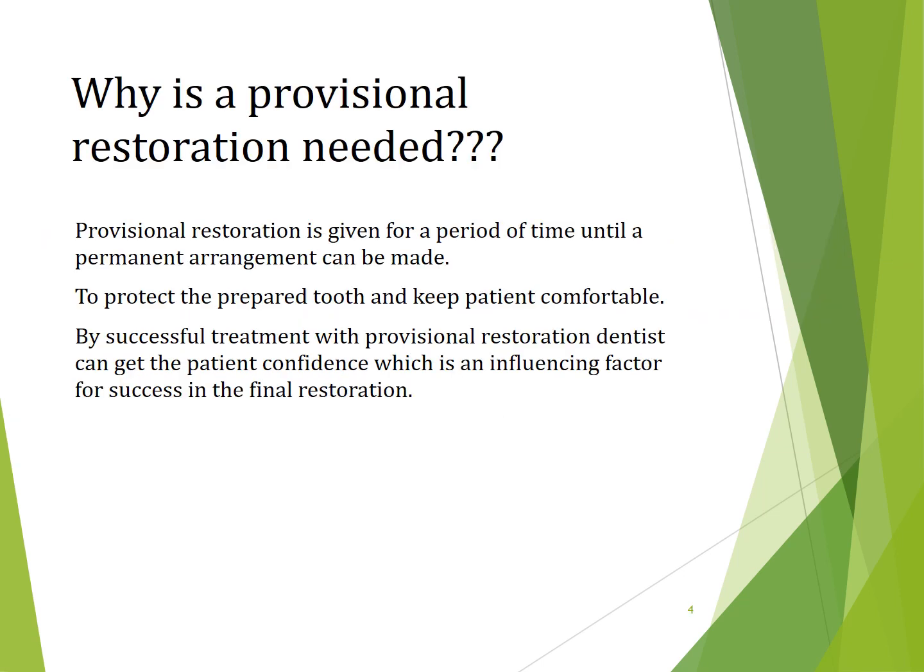Why is a provisional restoration needed? It is needed for the period of time until the permanent restoration is done in a patient's mouth. So, it is used to protect the prepared tooth or teeth and keep the patient comfortable. If we do a successful treatment with provisional restoration, a dentist can also make the patient confident, and it will help in influencing the success of the final restoration.